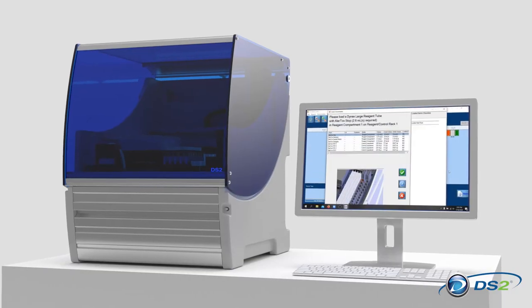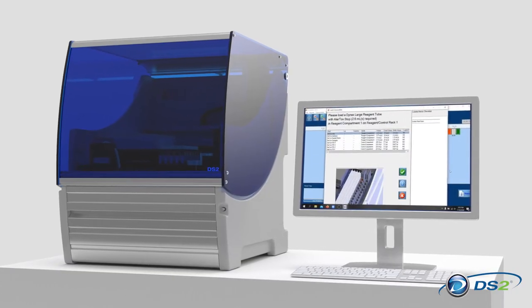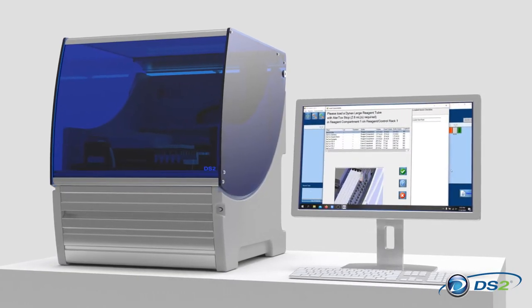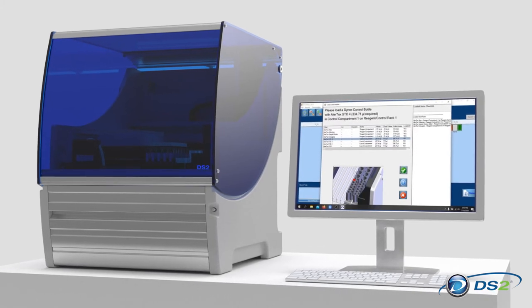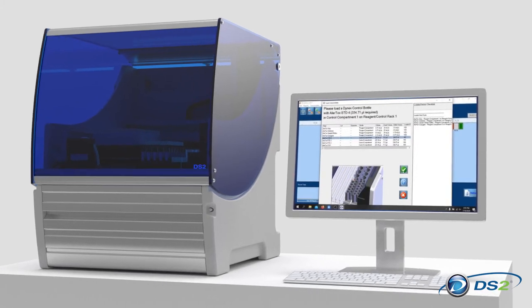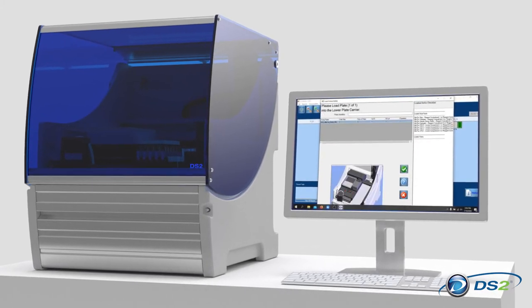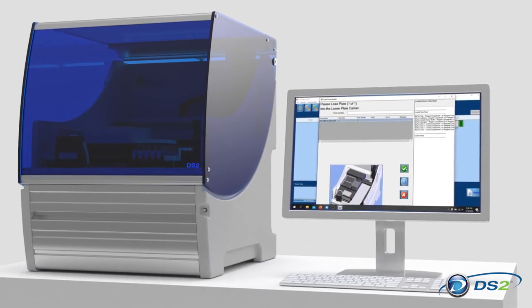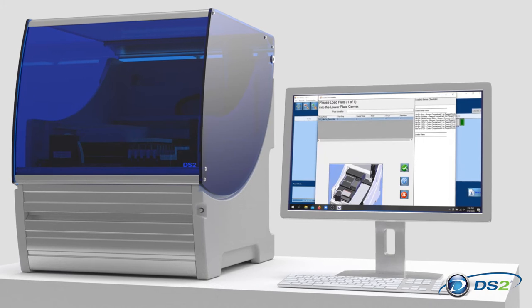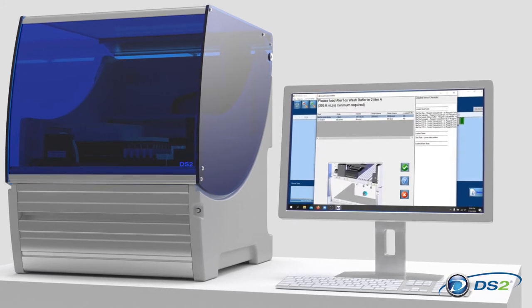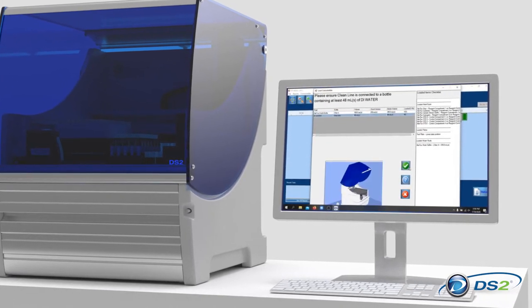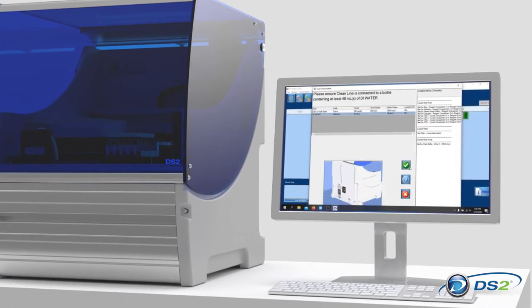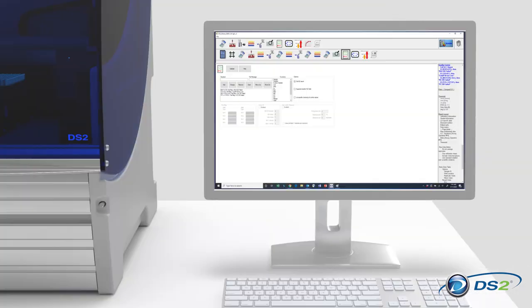The DS2 is easy to learn and maintain, requiring minimal training. The feature-rich DS Matrix software uses an intuitive graphical interface to guide lab technicians through complex processes showing exactly where to place each item.